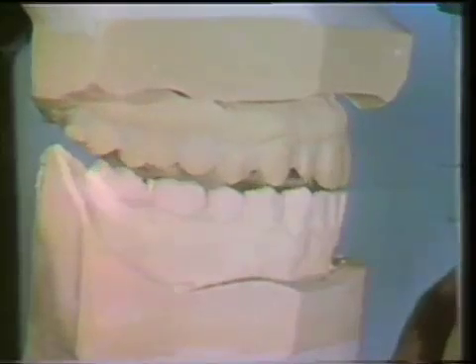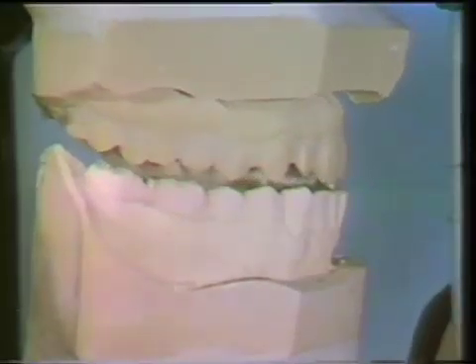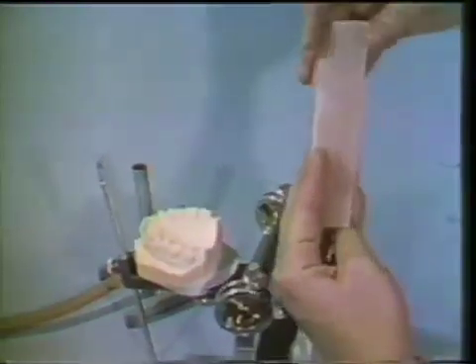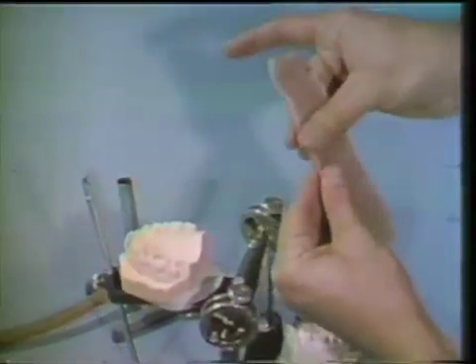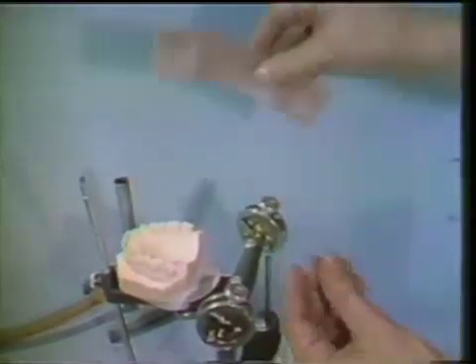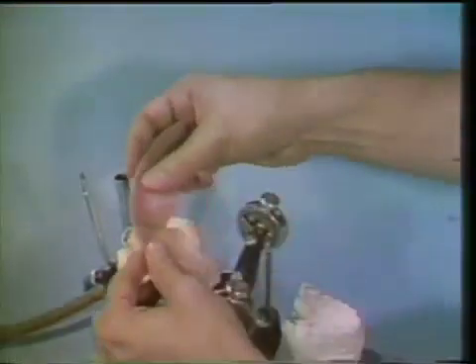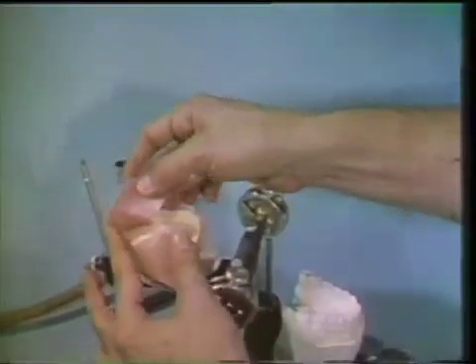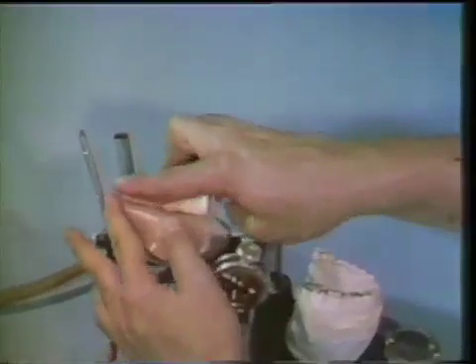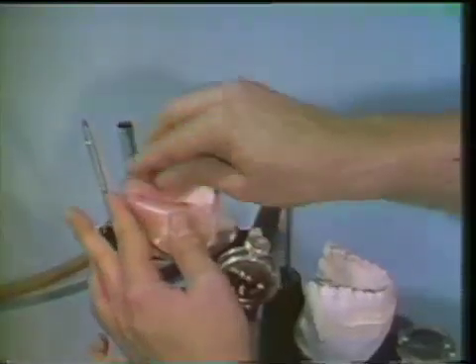When a deep overbite is present, the incisal pin should be raised sufficiently to clear the incisal edges of the anterior teeth. A sheet of hard base plate wax is softened. The wax is folded over and reheated, then applied over the teeth of the maxillary cast and molded over the teeth and surrounding areas.